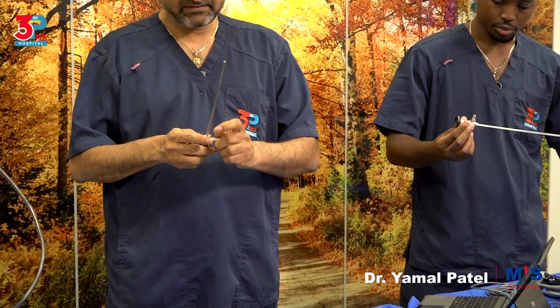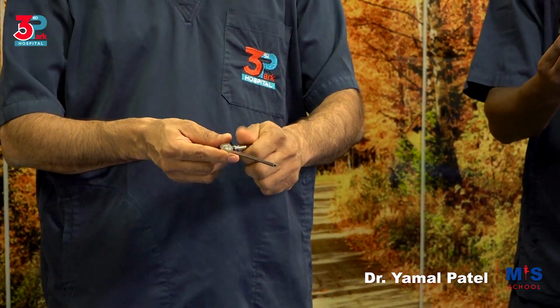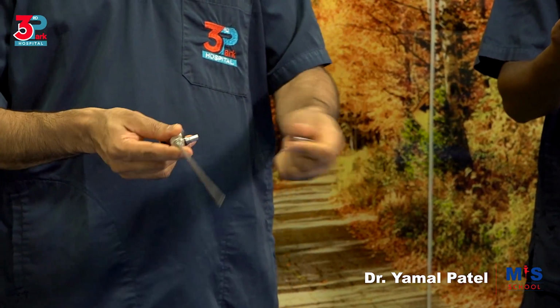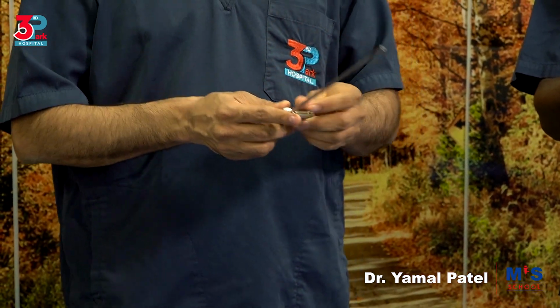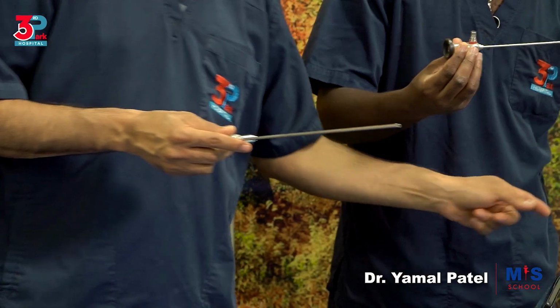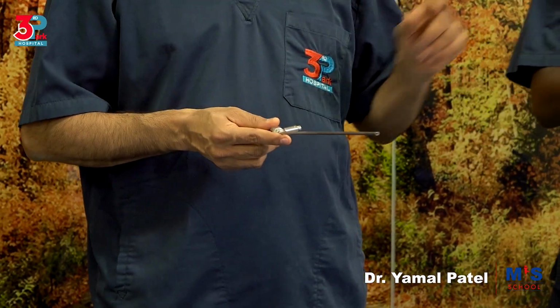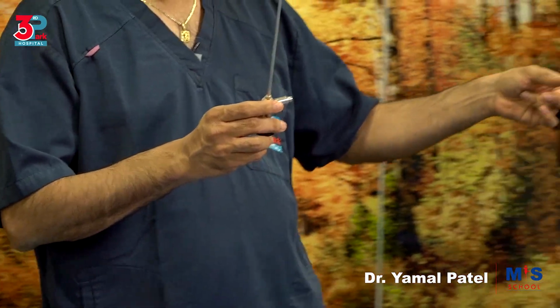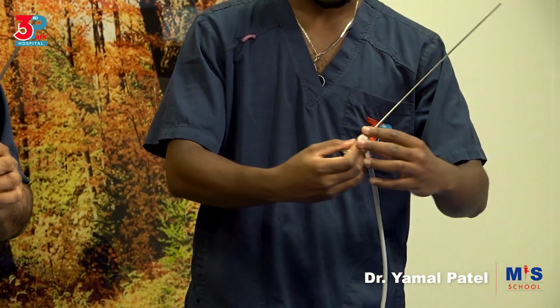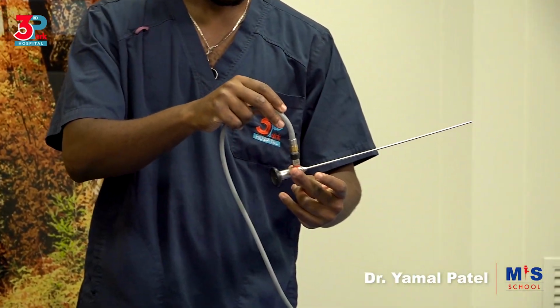So this eyepiece and the adapter has 3 connectors here. Depending on the type of cable you may use to connect to these, you can connect the tubing, the light, yes. So this is how you would connect the tubing to the eyepiece, to the light adapter.